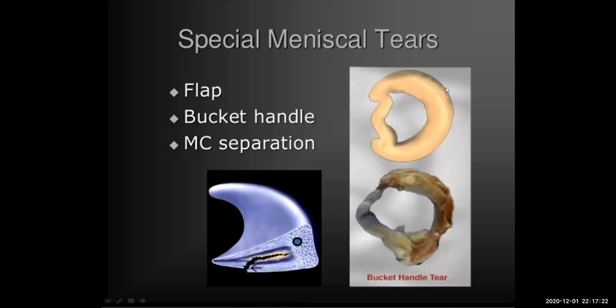The patient presents with a typical history of locking or pain or catching sometimes, or clunking or a clicking sound. Then when you do the arthroscopy, you find everything is normal. This is a kind of pathology that you can never predict unless you probe the meniscus. Then you can say the translation of the meniscus exceeds the summit of the femoral condyle, the maximum point of convexity of the femoral condyle. If it exceeds this point, most likely this is the cause of the pathology, the clicking and the locking. Again, it needs some repair and the outcome will be good.